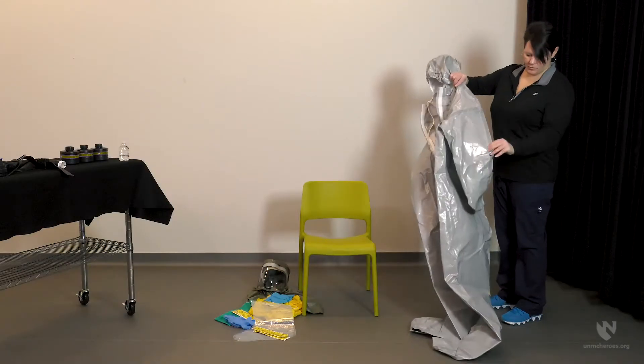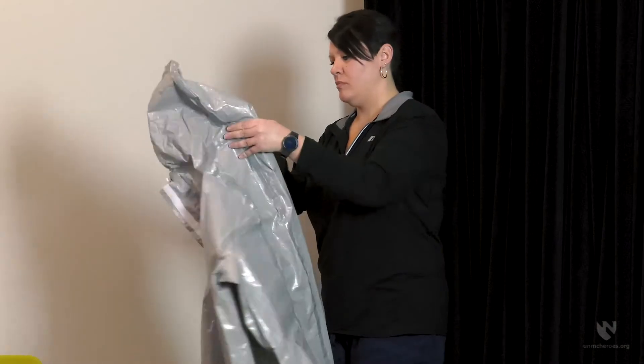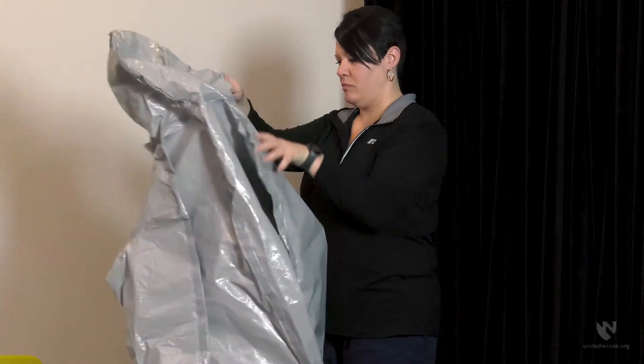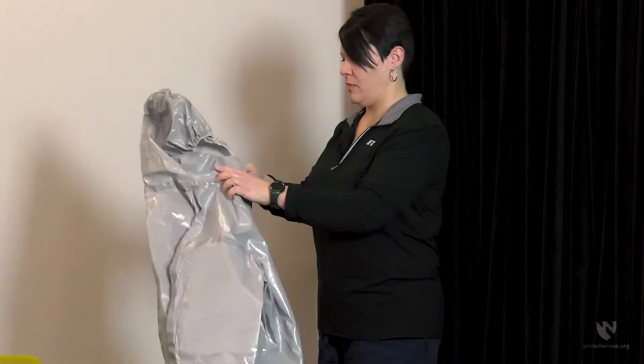Start by inspecting all the equipment that will be needed for the donning process. The seams of the suit should be examined for any tears or broken seals. For this video, we will be using the 3M Breathe Easy PAPR. If you are utilizing PAPRs manufactured by ILC Dover, please refer to the HEROES video for ILC Dover PAPR Assembly and Testing.